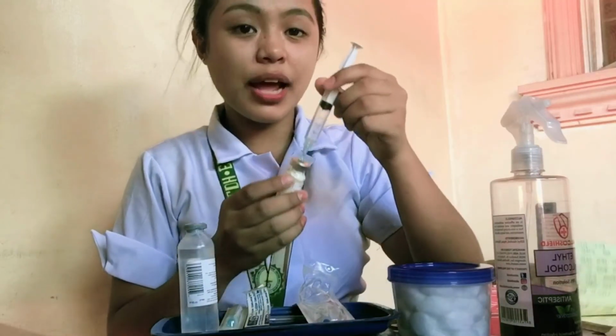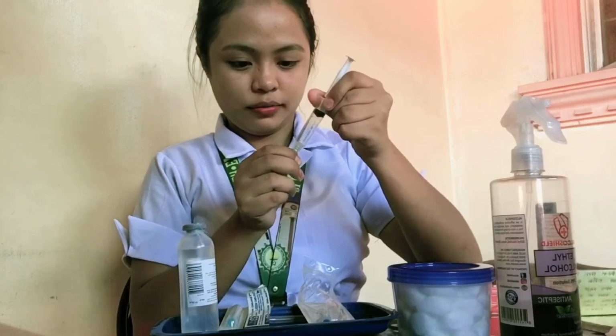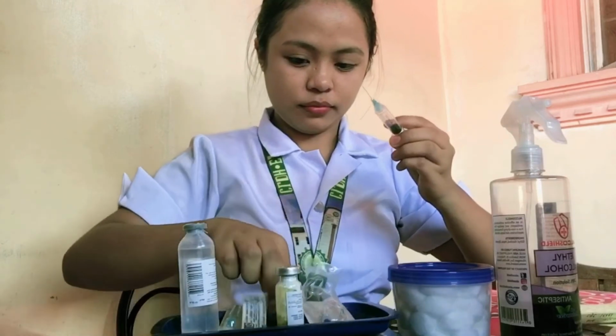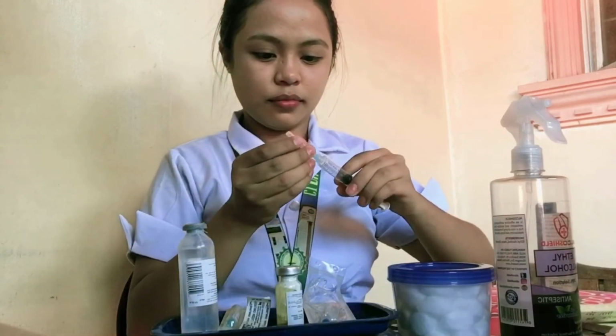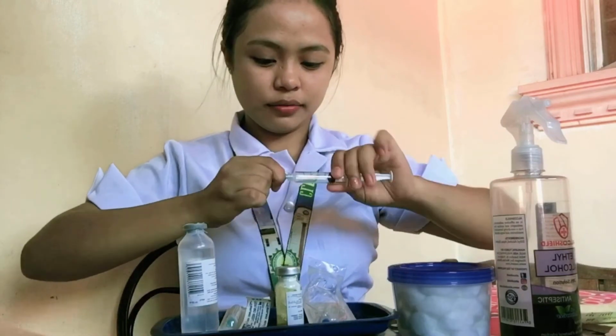Alright, after that, we need to remove our aspirating needle and return it to its original needle.